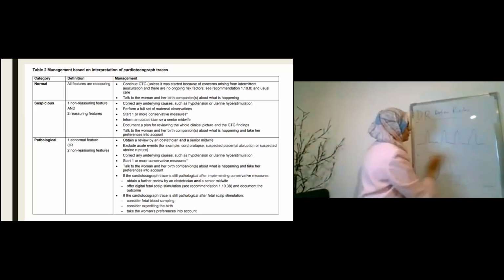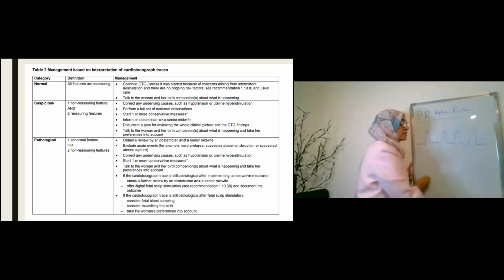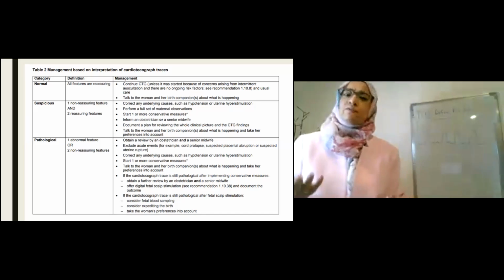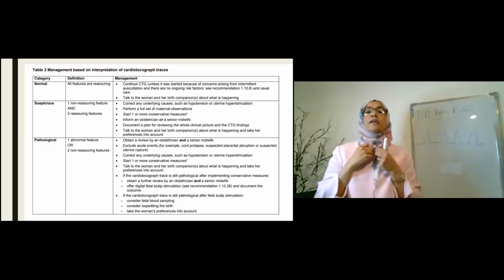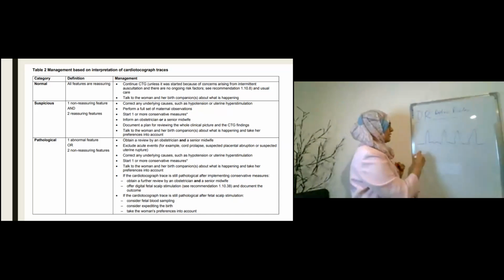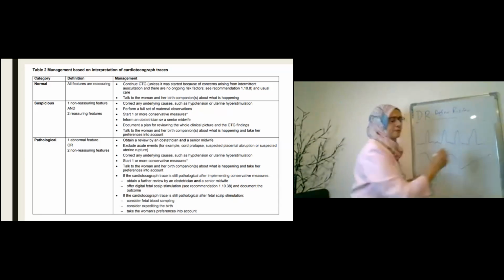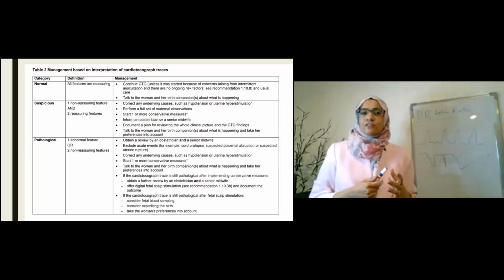Doing what we do all night, in terms of looking at CTGs, and this small writing that you are also looking at, and you say, okay, for your exam, you are going to read it. I am responsible for looking at at least 14 to 15 patients per night in 14 different rooms, looking at little squiggly lines going like this and maybe like this, or was that a right tick, in 14 different patients. So do you think I can get it wrong? Yes, I can get it wrong because I get tired.